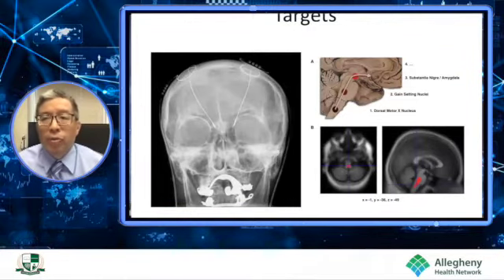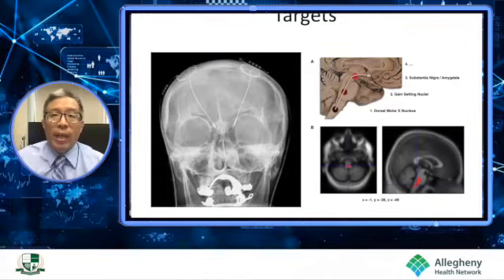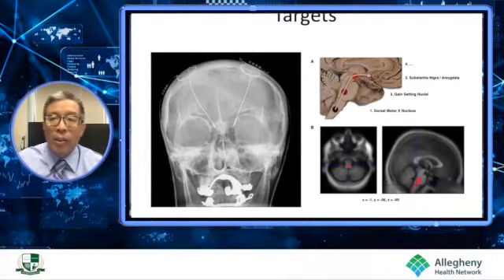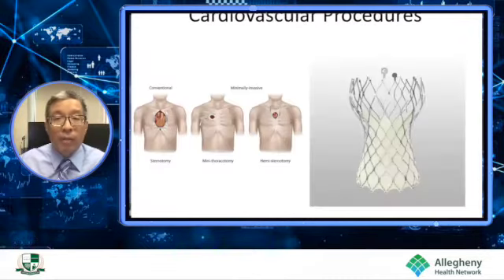An exciting area for us within the Neuroscience Institute is specifically the area of neuromodulation. In this category, we see that there has been tremendous strides made in the imaging aspect. Not only has the imaging been instrumental, but we also know that navigation has benefited from increased imaging capability. That in combination with a lot of the lead technology, the IPG technology, really has broadened the area of neuromodulation, but it's a clear example of how imaging and specifically navigation have benefited this type of technology.